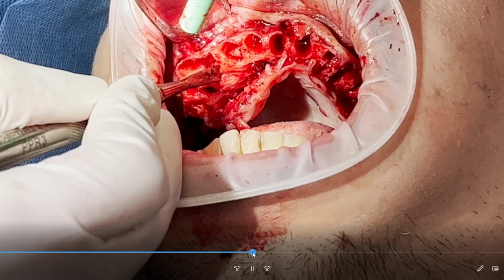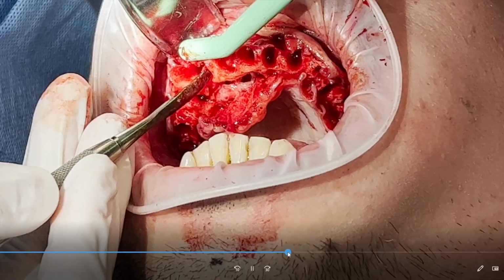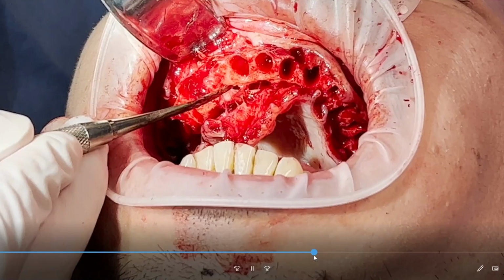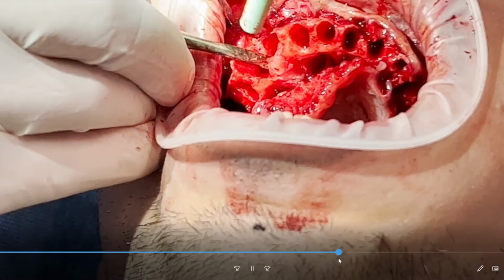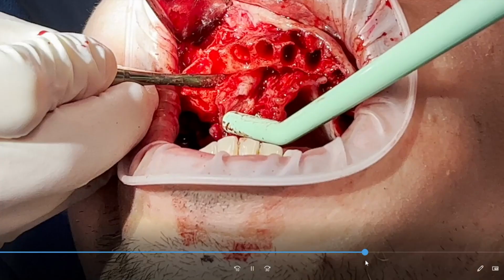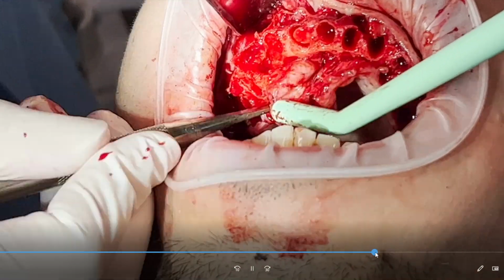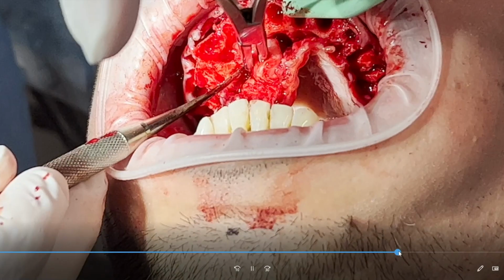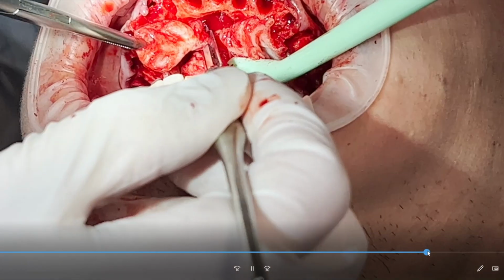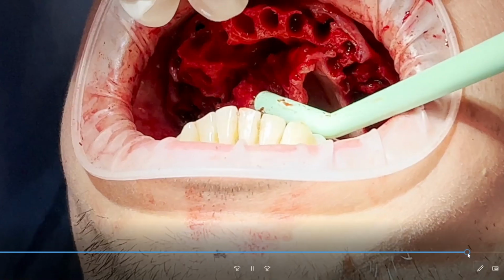So here we go. Now I'm trying to separate the cyst from the bone. And you're going to see me mess around with that quite a bit. It's starting to loosen up, loosen up, loosen up. Let's go a little faster. And there we go. We see the cyst still adhering to the gums there, and we're going to separate that. I'm going to cut that off. There you go, you can see it real quick before I cut it off. I'm going to fast forward here so we don't catch his face.